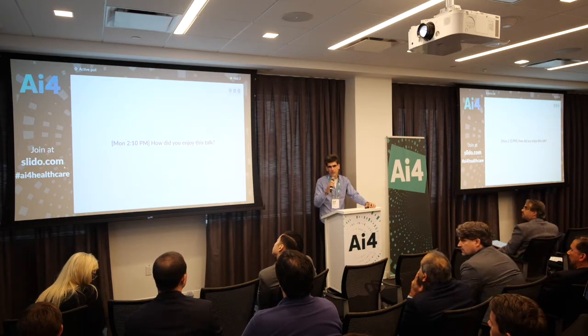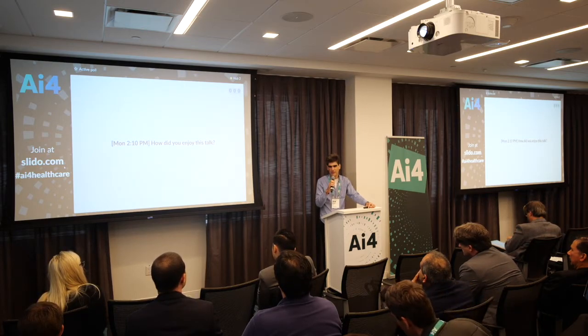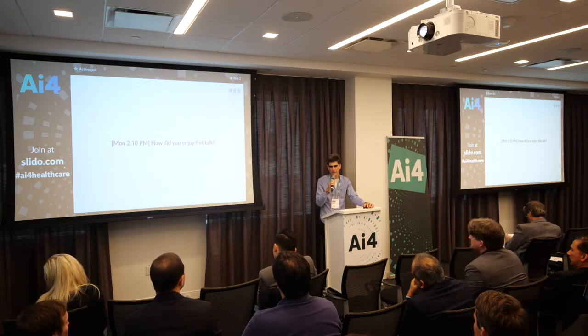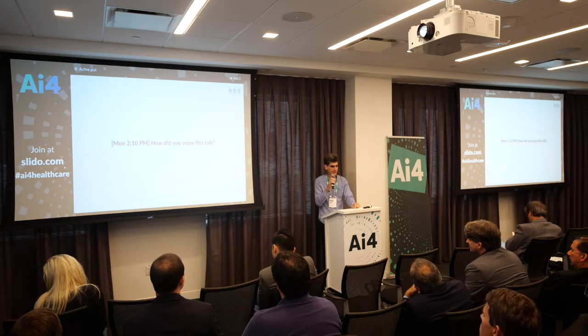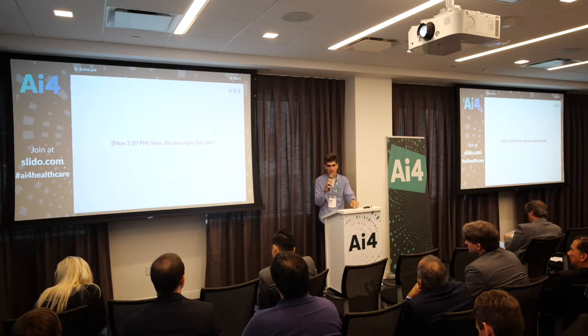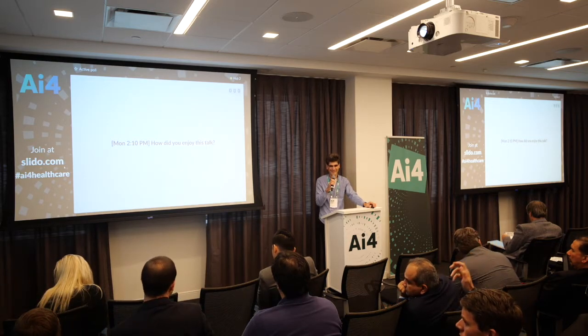So sometimes it's helpful to do joint classification and segmentation. You actually want to train the same network to do segmentation of the cells and to do classification. In other cases, you're right, and it's enough to do classification based on a patch. But in some cases, what you find is effective is either to do joint training or to force your classification network to only look at something that's close enough to the nucleus that you have found. So it depends.